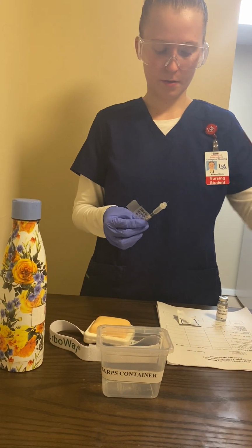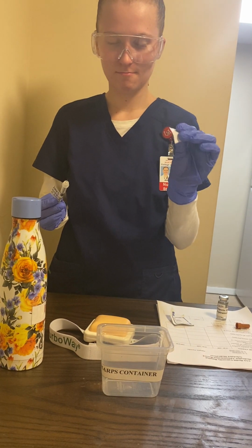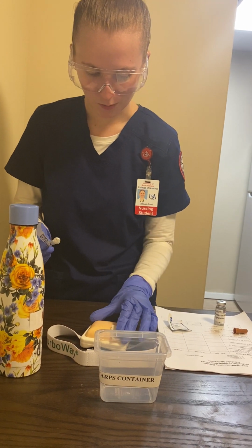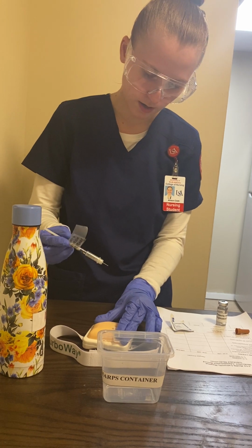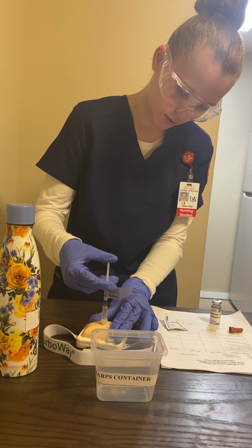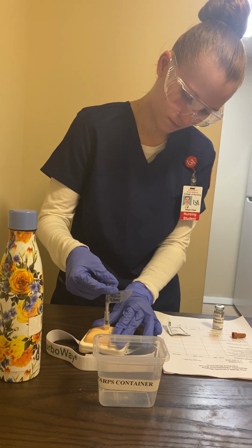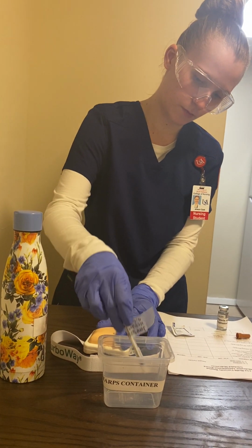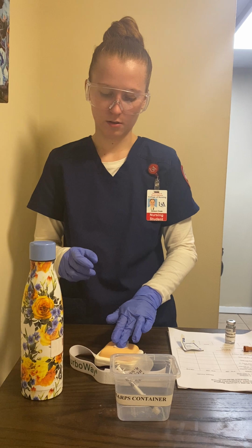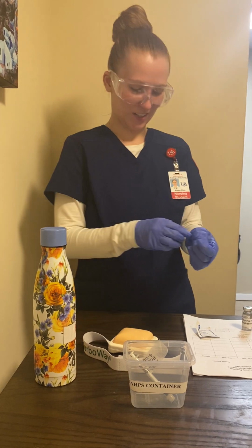Now I'm going to uncap the needle. I'm actually going to put this right here before I threw that away. Obviously that's not sterile, but we wouldn't do that in real life. Okay, so I'm going to go ahead and pinch. Go in at a 45 to 90 degree angle and slowly inject. Now we're going to take it out, immediately put it in the sharps container, and put the alcohol pad over the site in case it gets to bleeding. Hold for 10 seconds. Now I'm going to throw it away.